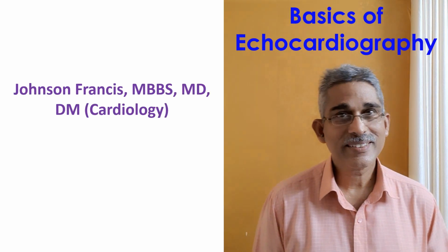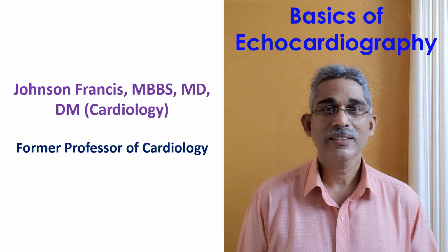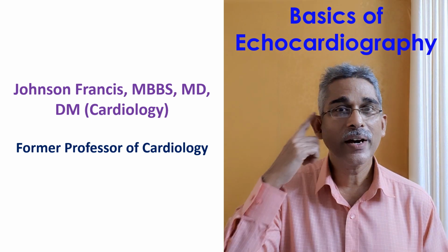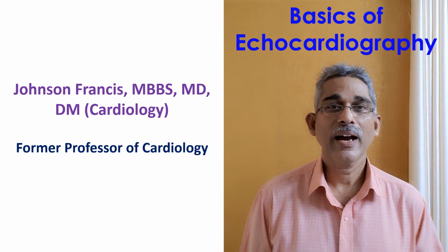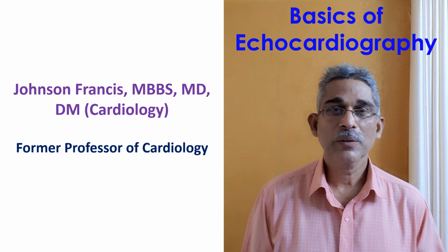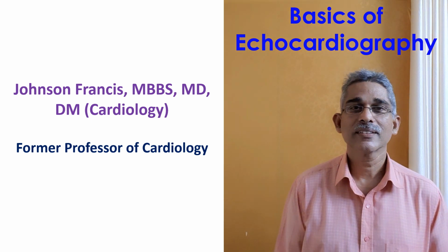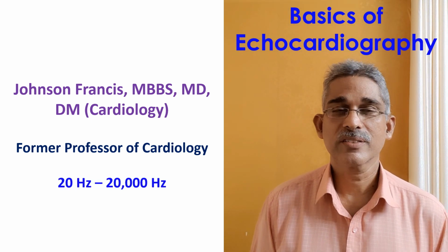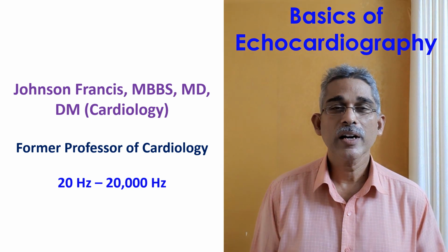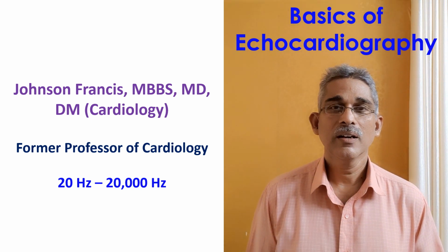Echocardiography is ultrasound imaging of the heart. Ultrasound is sound wave which cannot be heard by the human ear. Normal human ear can hear sounds from the range of 20 Hz to 20,000 Hz. 20,000 Hz will be 20 kilohertz. So this is the normal audible frequency of the human ear.